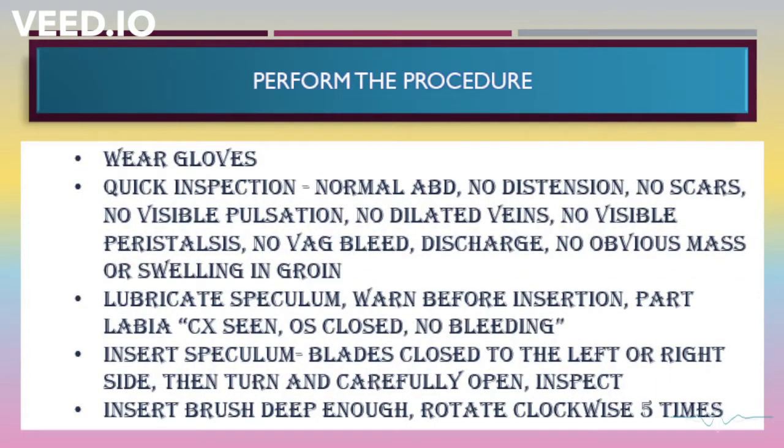Now, perform the procedure. Wear the gloves, do a quick inspection, look at the abdomen, whether it is normal, any distension, any scar, visible pulsation, any dilated veins, any visible peristalsis, vaginal bleed, discharge, any obvious mass or swelling in the groin. After you've inspected, you would need to lubricate the blades of the speculum. Warn the patient before inserting the speculum.